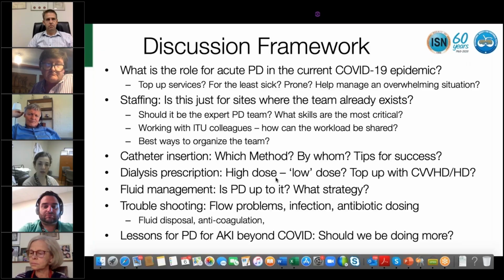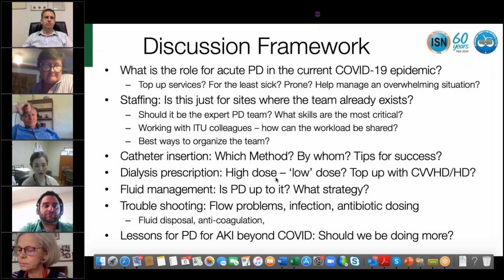After about a week, we were able to get 15 cyclers, and we started setting up the cyclers, we being the nephrologists on the task force. At this point, we were joined by a nurse practitioner and some other trainees who were helping out manpower-wise. So we went around and used the ISPD AKI guidelines, programmed the cyclers for the patients, and came later and took the patients off. So that's a very brief description.